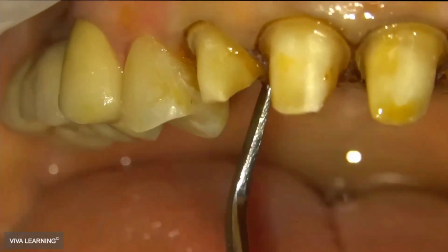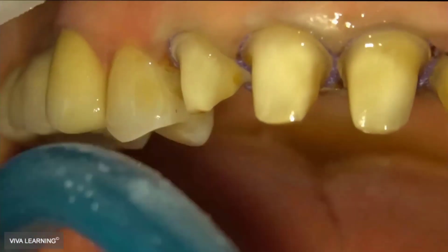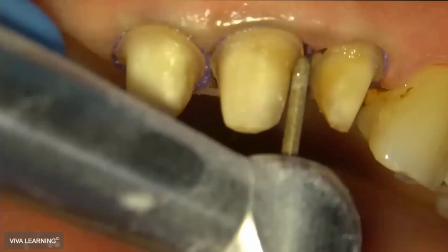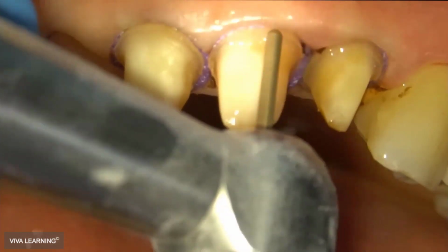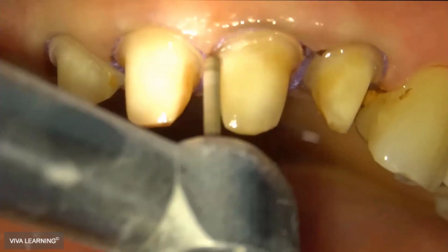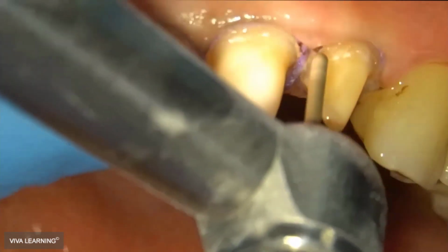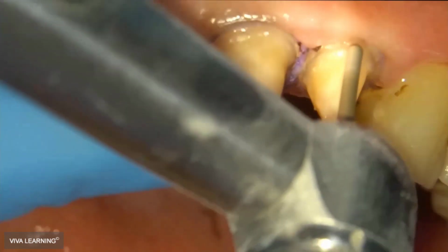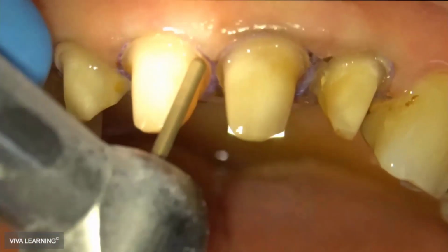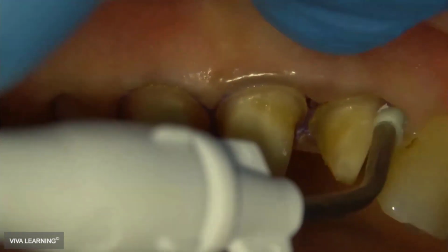And for this kind of procedure, I like to place the first cord to get a little bit of tissue displacement in the vertical way. So when I do the marginal finish, I always use burrs that are fine grit burrs. I usually use the red burrs, because even if you touch a little bit the tissue, you will not tear so much the gingiva, and you will not have a lot of bleeding.